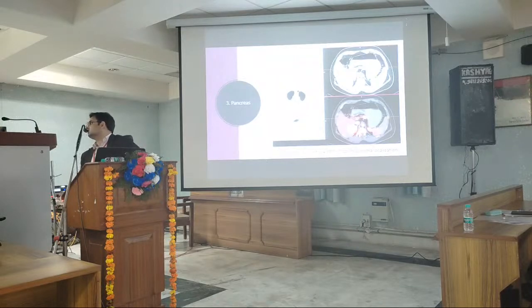So the important thing is that these patients are sometimes following for many years in psychiatry or neurology OPD with vague symptoms and complaints. When we checked the blood glucose, it was low and insulin levels were high. So one thing was sure: something is producing insulin, which is causing hypoglycemia. On routine ultrasound and dual phase CT abdomen, which seems to be the best modality, we were not able to pick up the lesion. When we did a Dotanoc, there was a clear-cut signal. And the patient has been following up for a couple of years post-op with us and is doing very well.